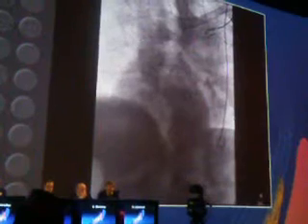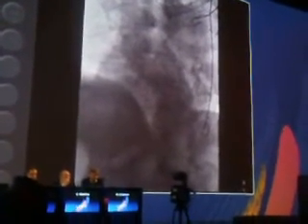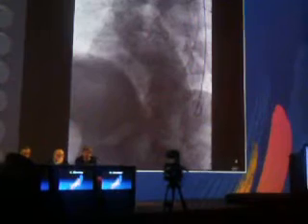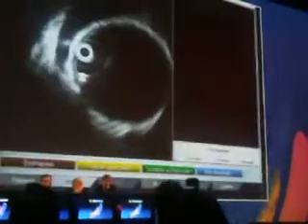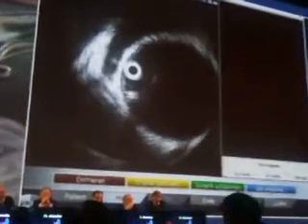I think this technique gives you the highest chance to remain in the true lumen. You can, of course, check this with transesophageal echo. We have here now an IVUS. Maybe we can switch to the IVUS. We have also loaded a stiff wire, a Lunderquist wire, and here you can see now the IVUS.